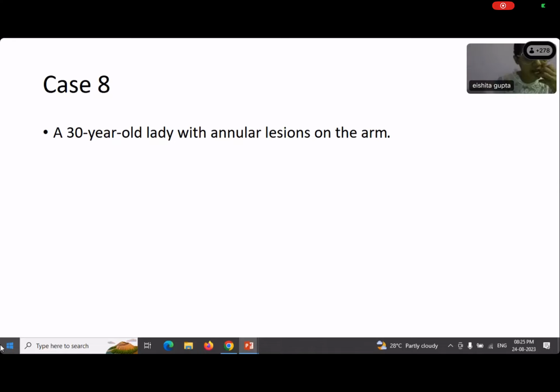Another point I'd like to mention is regarding the nerves. Here in lepromatous leprosy, the nerves are relatively better preserved, so you can see the onion skinning. But what happens in tuberculoid leprosy, especially if the biopsy is inadequate, is you don't see any nerves at all because the nerves are completely gone. So in such a case, you may have problems definitely signing out as leprosy. There are papers that recommend that you use the S100 stain and things like that, but it may not always be helpful in clinical practice. So the key in tuberculoid leprosy is to get an adequate biopsy to include the subcutis so that you can evaluate the neurovascular structures very well. But nevertheless, there are always cases where you don't find nerves at all, and yet the pattern is what helps you, of course, with the clinical correlation.